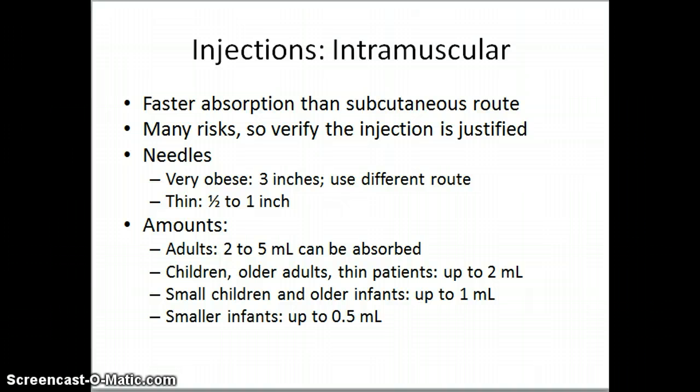The IM route is often used in the clinic for vaccinations and for administering antibiotics to children who need to get them in their system a little quicker than just going home with the oral antibiotics. The longer and heavier the gauge needle passes through very deep tissue, or at times I've had to go through the clothes or the blue jeans on very uncooperative patients, we would definitely use a larger gauge needle so we don't break that off.